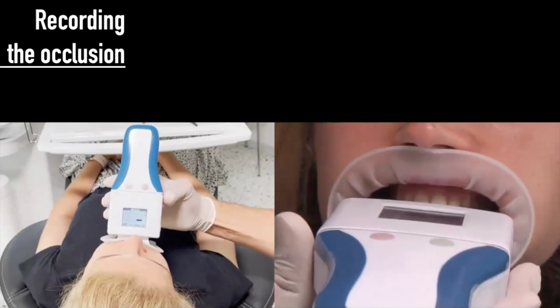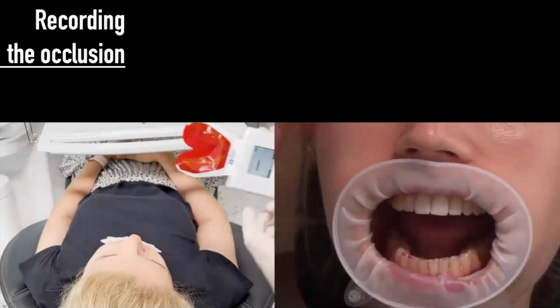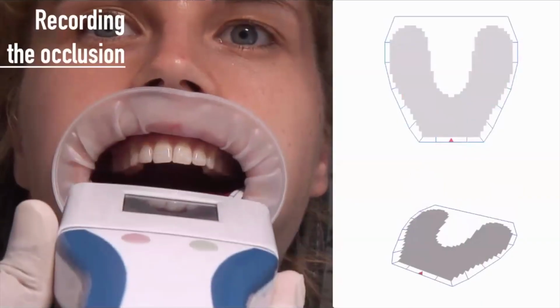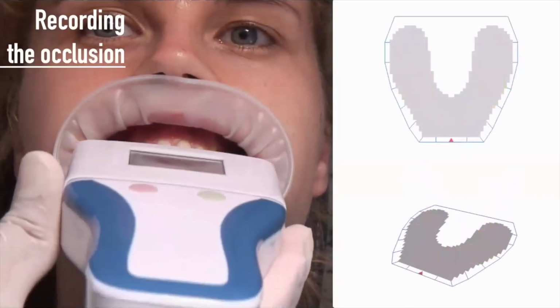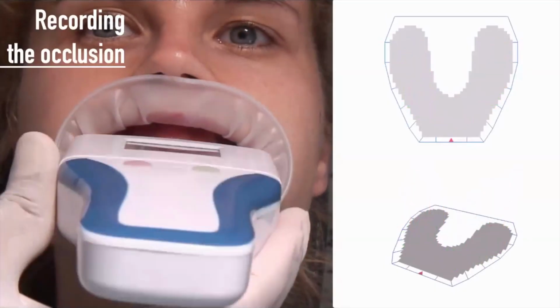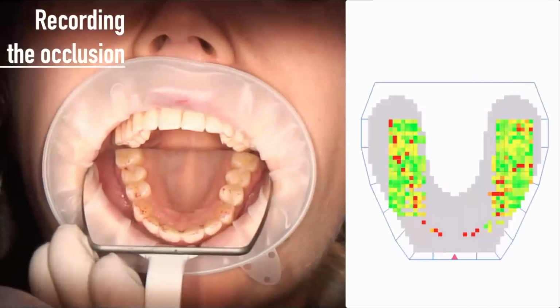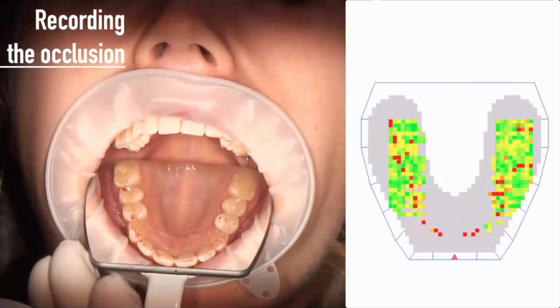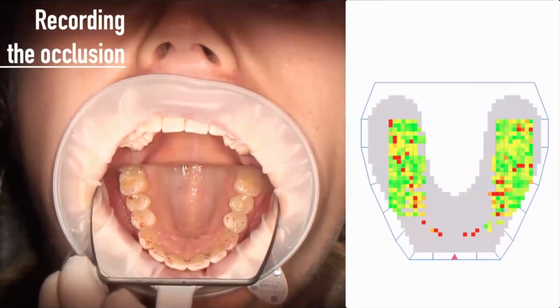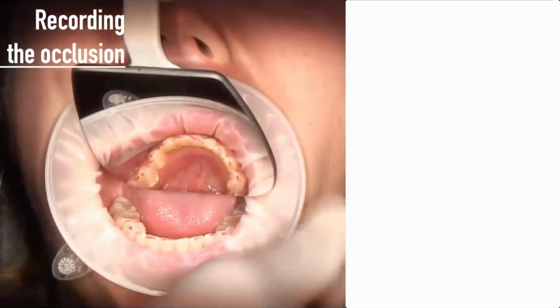So here we have first static occlusion and then going into lateral protrusion movement straight away. What you can also see in this recording is a live output of the OccluSense reading. And then I will show you how the markings are also left in the patient's mouth. So any adjustments that you are now looking to do, you can directly do without repeating any steps.